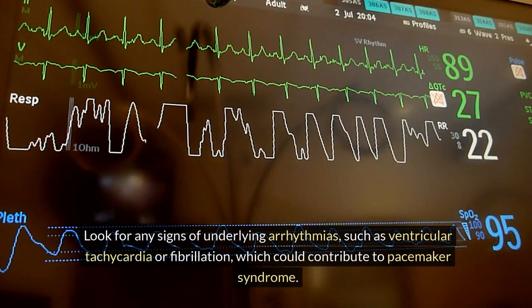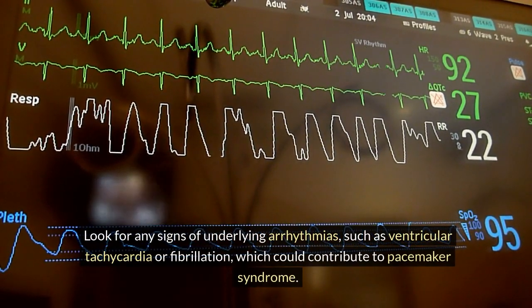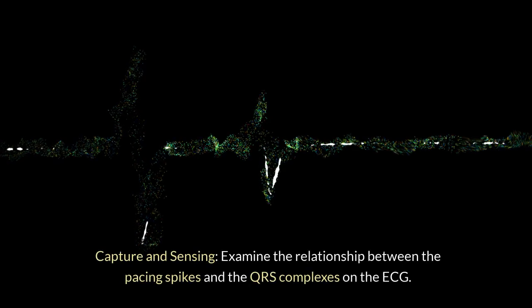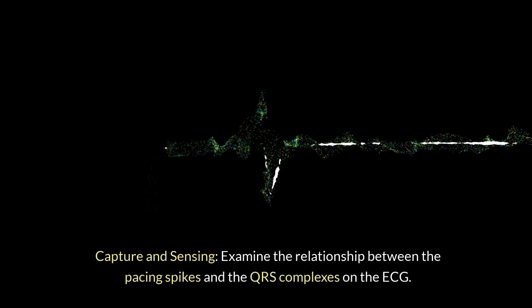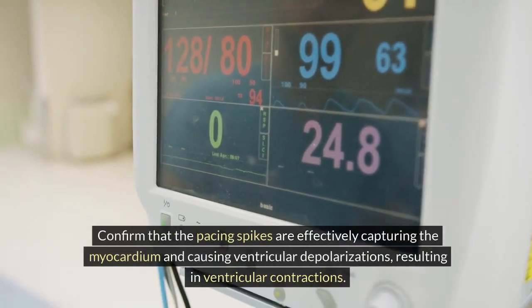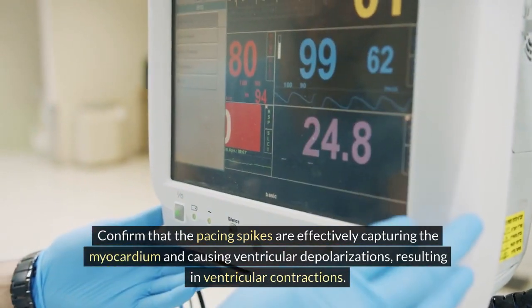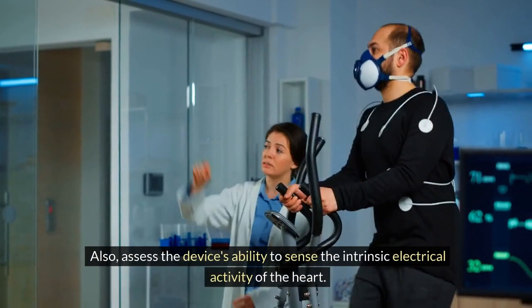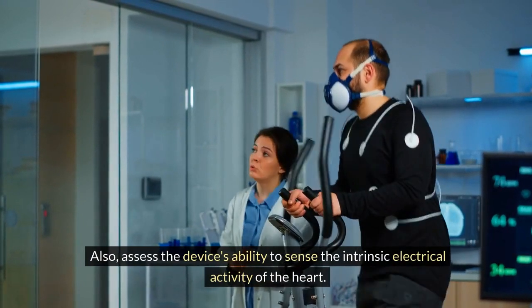Look for any signs of underlying arrhythmias, such as ventricular tachycardia or fibrillation, which could contribute to pacemaker syndrome. Capture and sensing. Examine the relationship between the pacing spikes and the QRS complexes on the ECG. Confirm that the pacing spikes are effectively capturing the myocardium and causing ventricular depolarizations, resulting in ventricular contractions. Also, assess the device's ability to sense the intrinsic electrical activity of the heart.